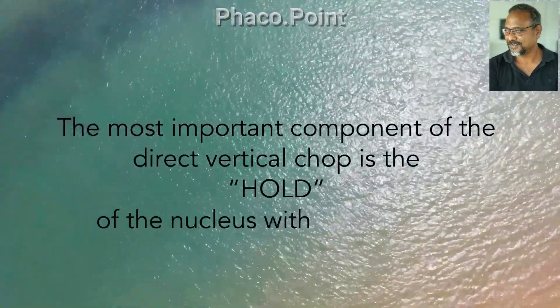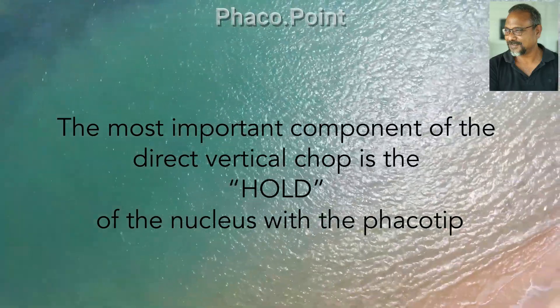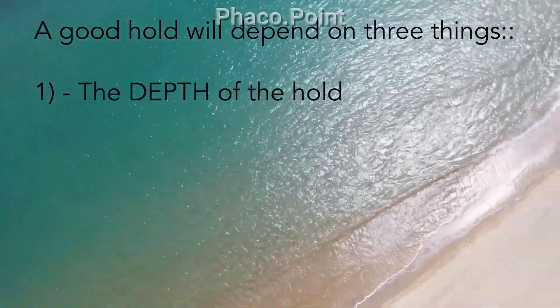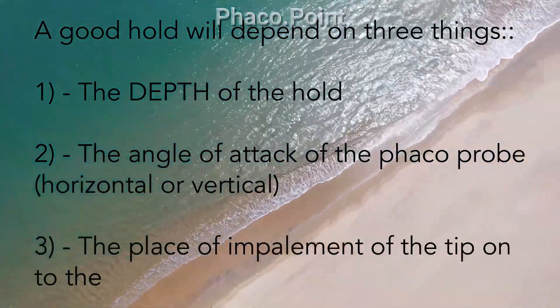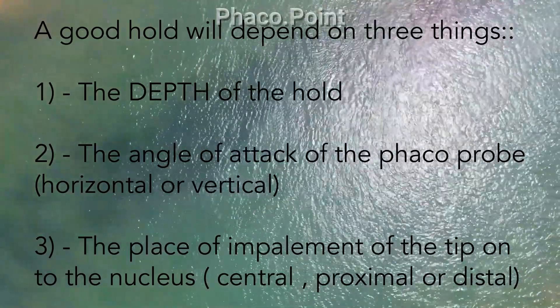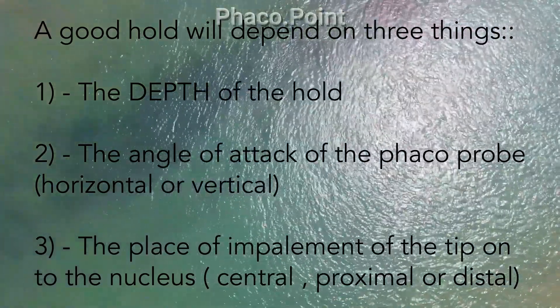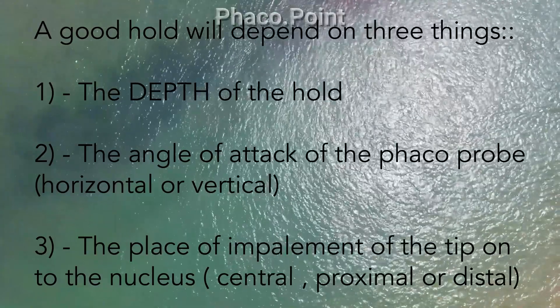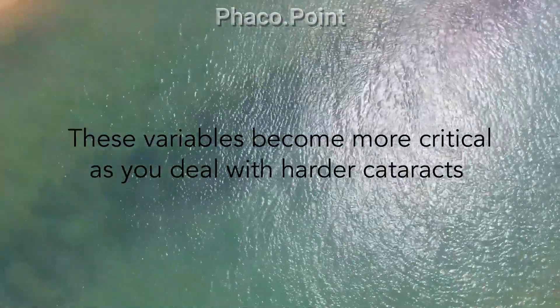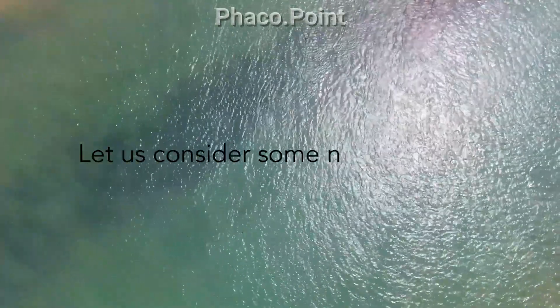The most important component of the direct vertical chop is the hold of the nucleus with the phaco tip. A good hold depends on three things: firstly, the depth of the hold; secondly, the angle of attack of the phaco probe, whether horizontal or vertical; and thirdly, the place of impalement of the tip onto the nucleus, whether central, proximal, or distal. These variables become more critical as you deal with much harder cataracts.